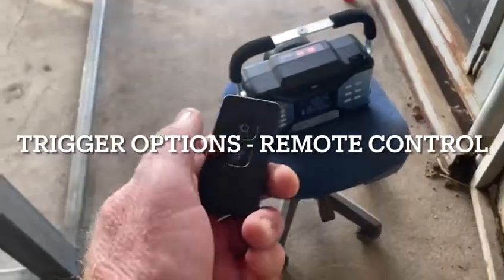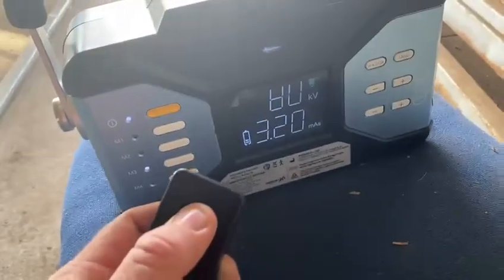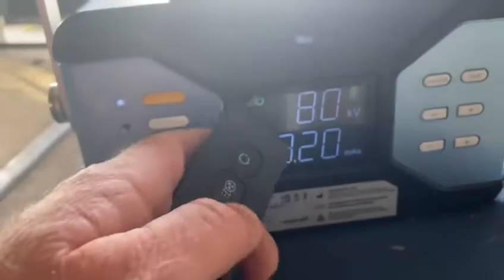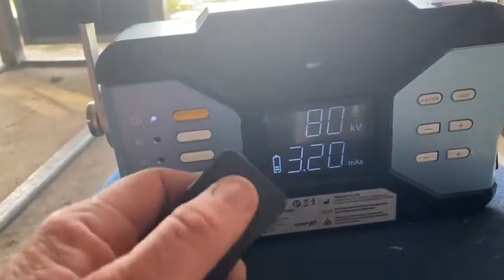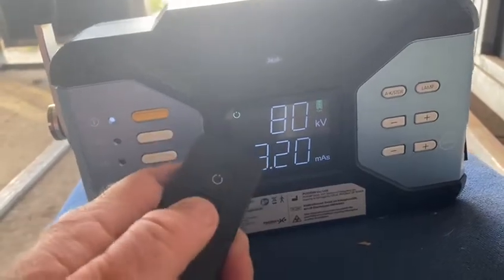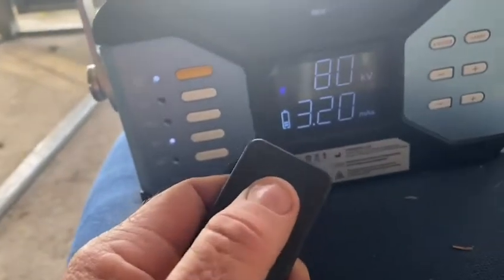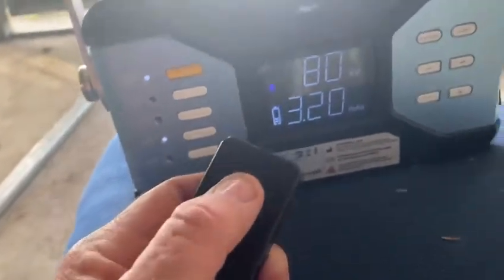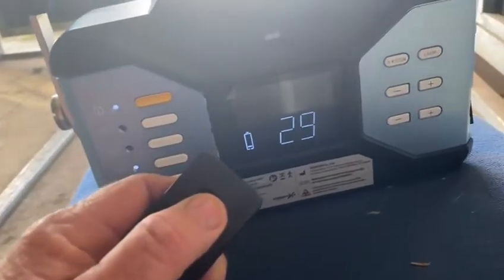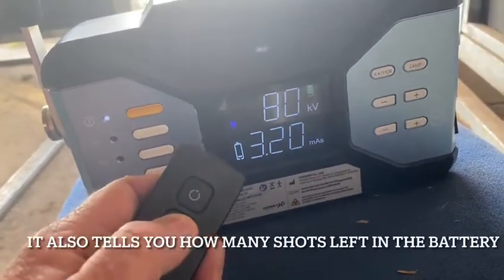You can use this remote control button here - press that and it tells you that the machine's ready. You've got to press the fire button when that light is on. You only have about a second after you press the initiating button. So you press that, it comes on, then fire.